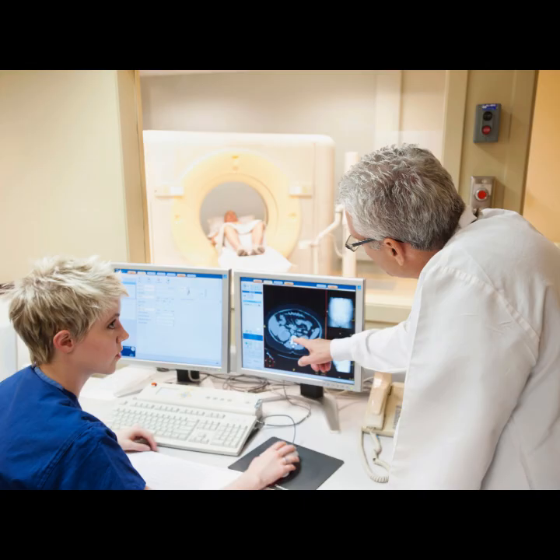I see why you favor optimization, but I think you sacrifice a degree of certainty for that efficiency. I support sticking with the fixed, structured trajectories, chief among them the Cartesian grid used in Fourier transform imaging, but also established radial and simple spiral patterns. The undeniable strength of this classical approach lies in its mathematical guarantee. You get simple reconstruction via the fast Fourier transform, the FFT, and crucially, highly predictable artifact behavior. When you need reliability in a clinical setting, certainty often matters more than maybe fractional improvements in speed.